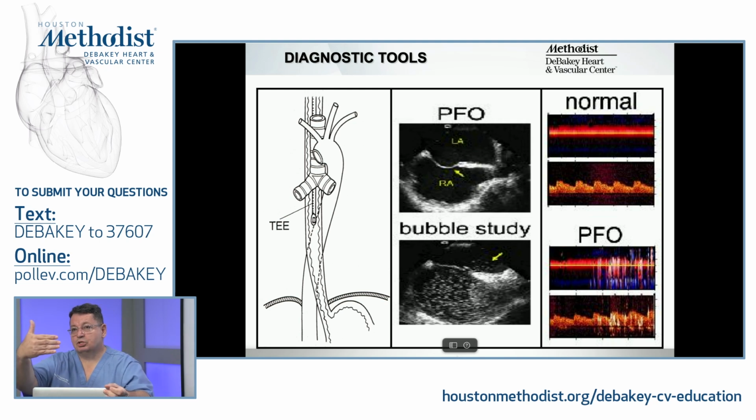So 2D pictures capture right there, where it's my screen. If my hand is behind the screen, you have no clue how many fingers I'm showing. And this is where the bubble needs to cross your 2D image to be able to see that. So if you have really few bubbles, this is why the echo is not picking those up.